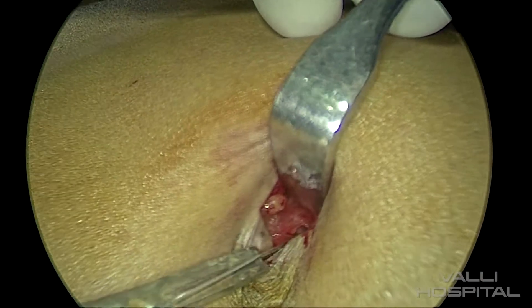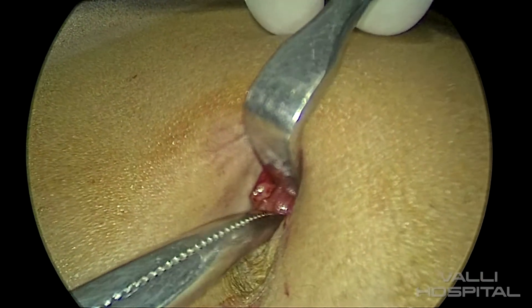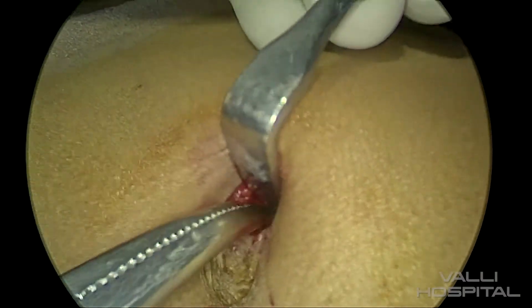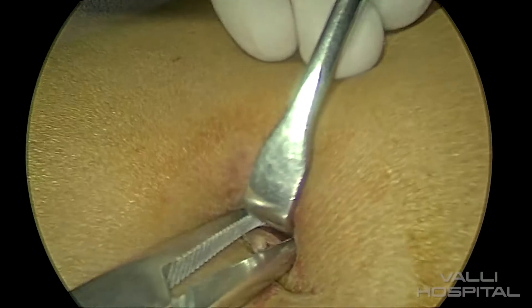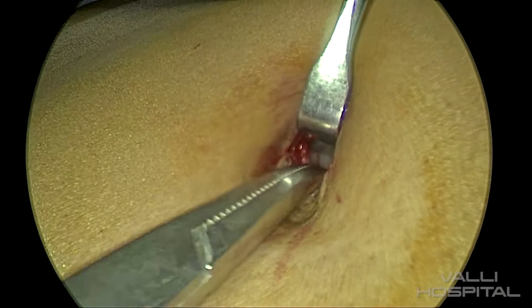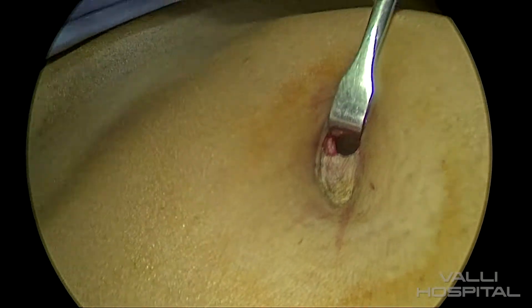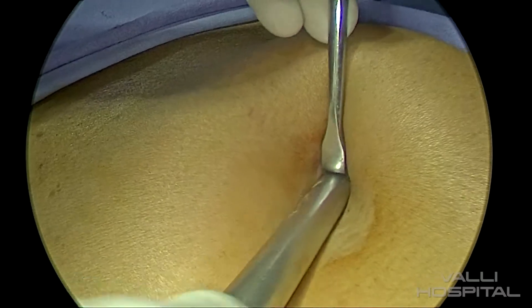Most of the time when we are doing laparoscopic surgery, we don't have the diathermy pencil available. In that case, you can use the Maryland — though it is a little bit cumbersome, you can use it. When there is a spurt, you should not keep digging inside a pool of blood — this is very important. So you have to avoid bleeding right from the skin incision. Use the gauze piece until you see the posterior rectus sheath, and then you can push in the trocar.